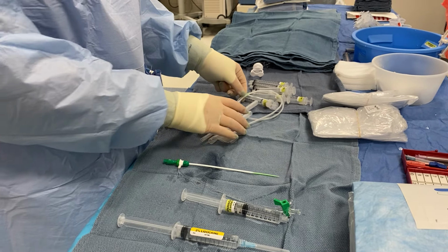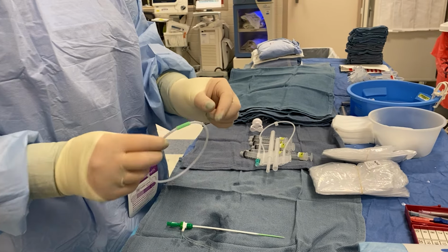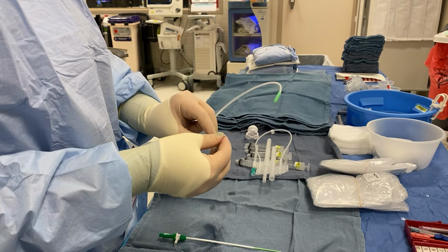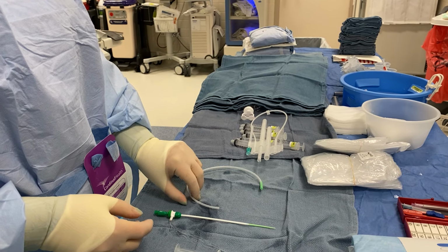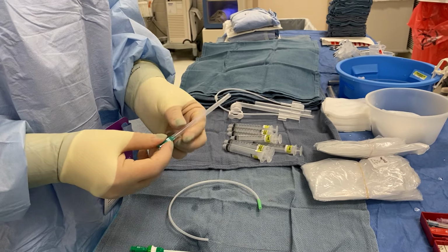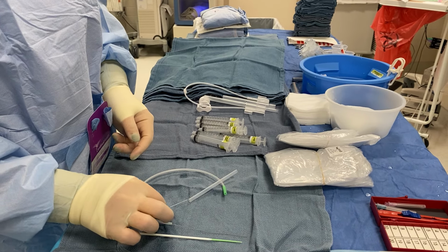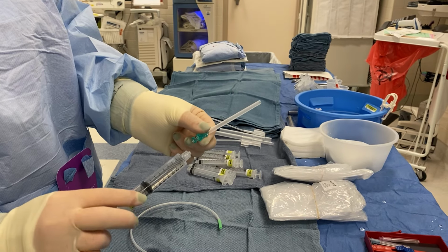Almost all sheaths will come with the wire necessary. So because this procedure we're going radial, it's gonna come with a very small wire, which is found in this hoop. So you just pull these two pieces apart, and the wire is sticking out right there. Now you can either pull the wire out completely or just leave it in the hoop for this part. I like to just leave it in the hoop. And then this sheath comes with the wire needed for access. Needle. Thank you, needle. And it looks just like that. We wanna keep it covered though for safety. You don't wanna accidentally poke yourself. So we're just gonna keep it covered, and I like to give that a little flush as well.